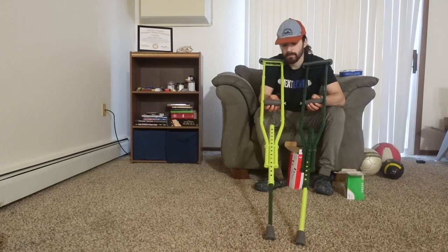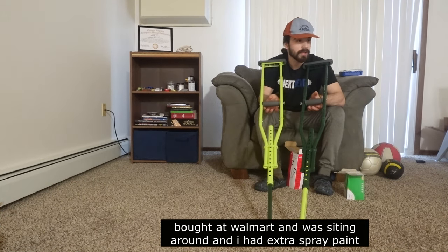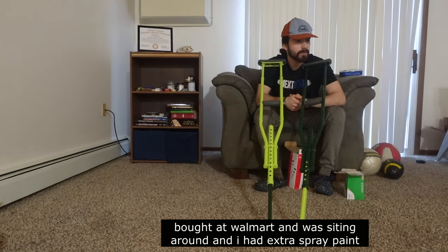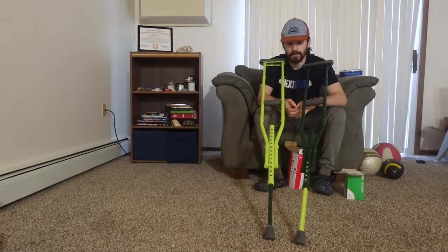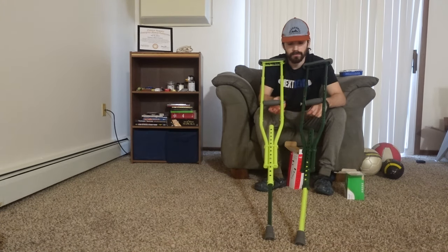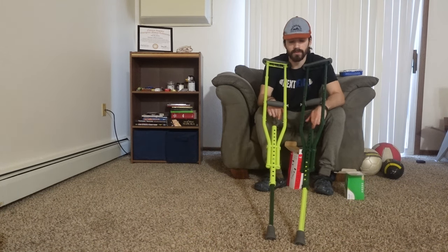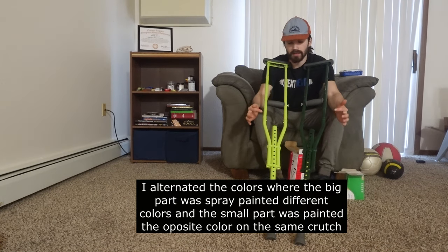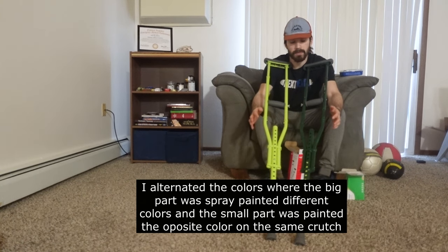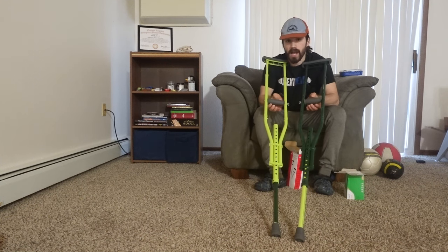I used them a little bit and I had them sitting around. I had some spray paint sitting around and I decided to spray paint them. And as you can see, each crutch has two different colors on it. The biggest part was spray painted one color and then the smaller parts were spray painted the opposite color of what I had on hand.